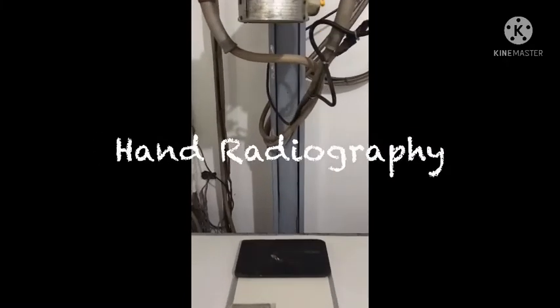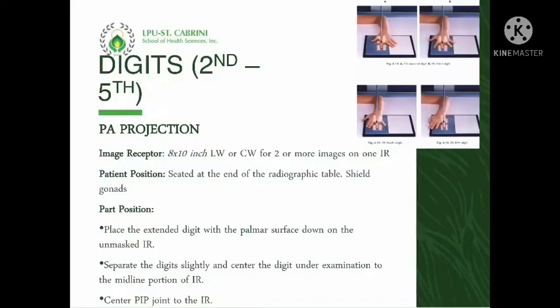Before starting every X-ray examination, make sure that the midpoint of your central ray is centered to the midpoint of your IR. Let's start with the projections for the digits. The IR used for PA projection of the second to fifth digits is 8 by 10 inch in lengthwise or crosswise orientation if there will be two projections on one IR.